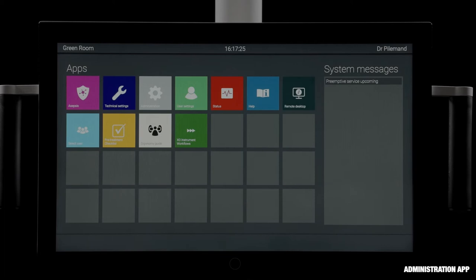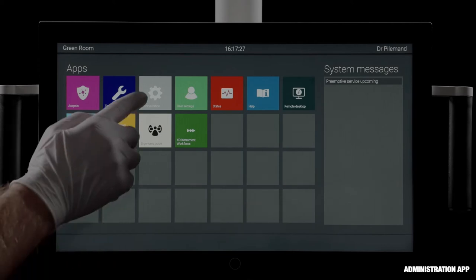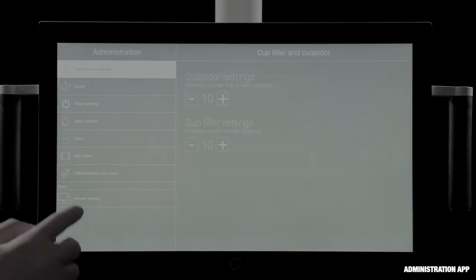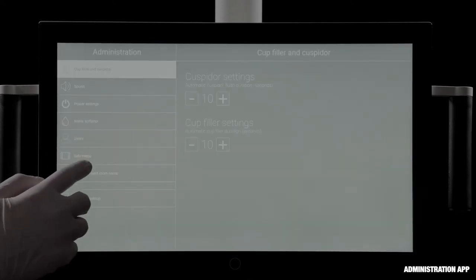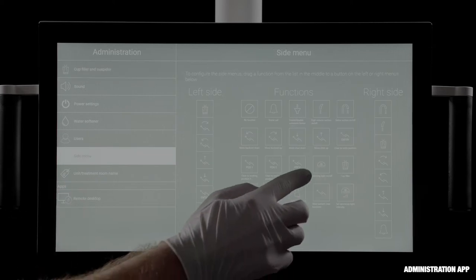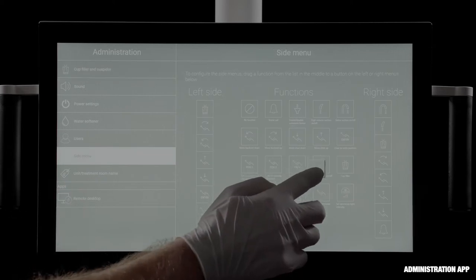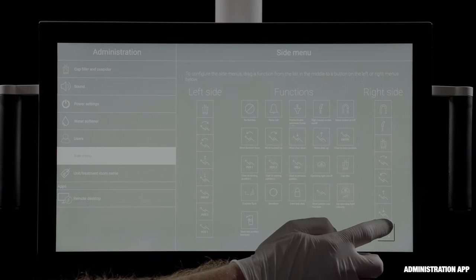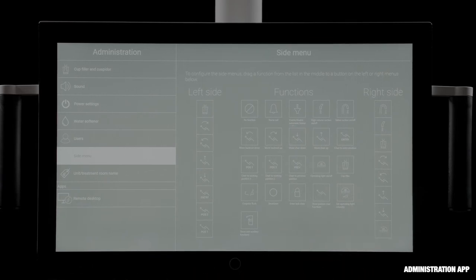The Administration app is used to configure the unit. It's possible to change the setup of the buttons in each side of the dashboard. Just drag and drop the selected function to a specific button.